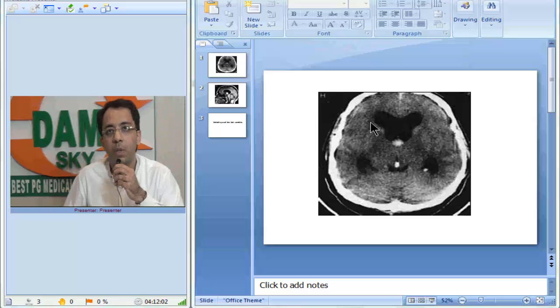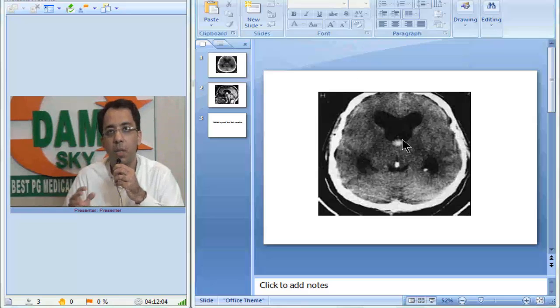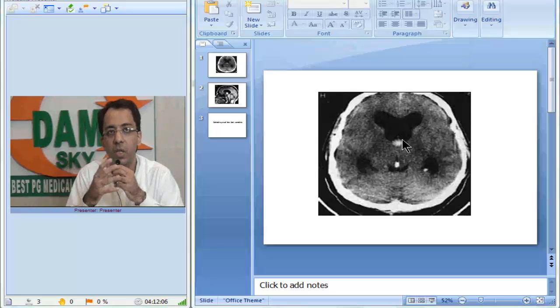So this is the posterior part, this is the anterior part. So what do we think of it? What is the differential that we think?